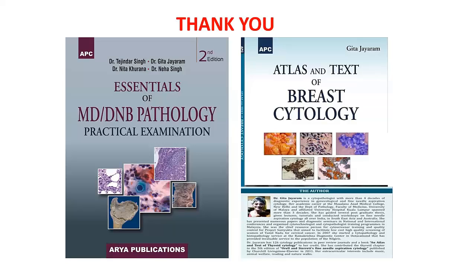What is the difference between atypical and reactive lymphocytes on morphology? See, some of us call them atypical, the majority of us call them reactive, others call them virocytes.